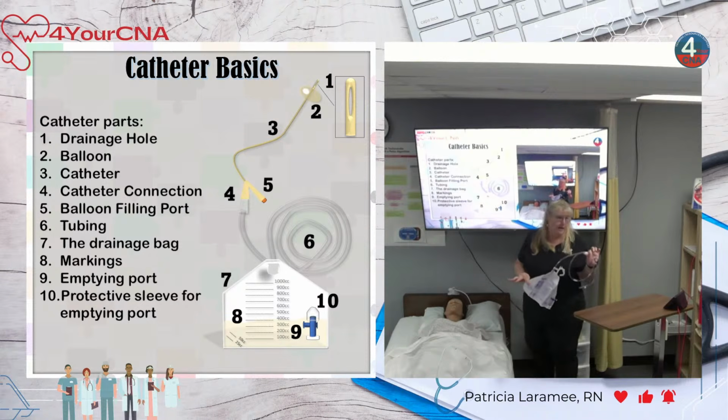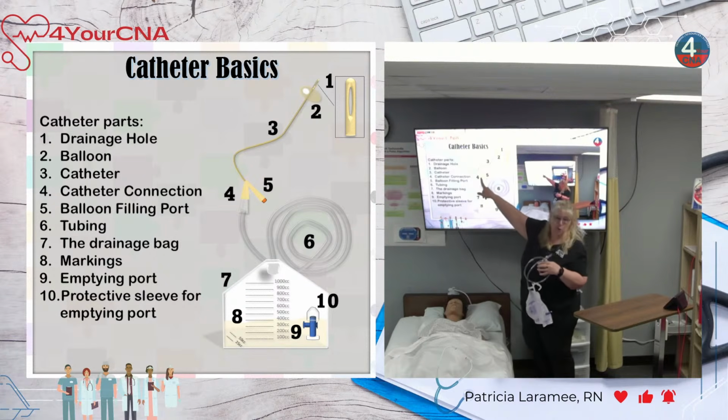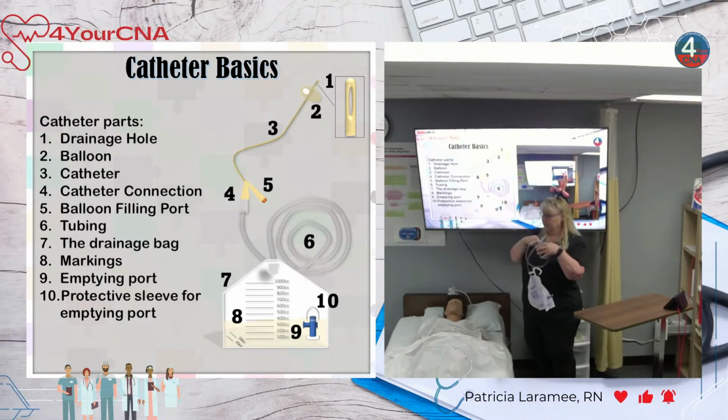There's different kinds of bags. They all work pretty much the same. They hold urine. Pretty much it. This port here is what attaches to the other port of the catheter. And it literally plugs in. But it's snug. You kind of have to work at it because, again, we don't want leakage, okay?